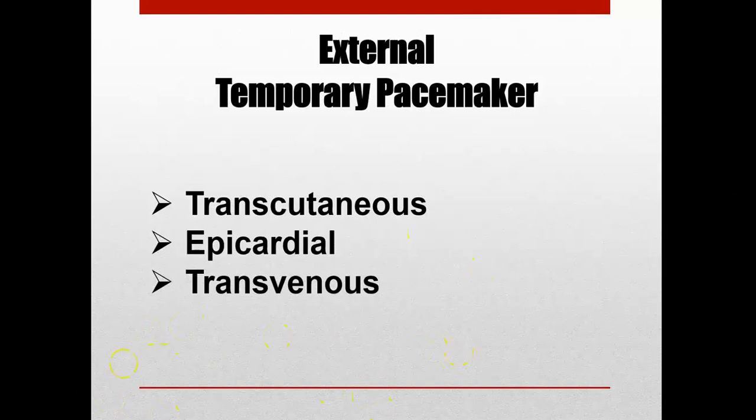The other wire is then used for a positive or a ground electrode, and the leads are pulled through the skin before the chest is closed up. Atrial leads exit on the right side of the sternum below the ribs, and ventricular leads exit on the left side of the sternum below the ribs. So atrial is right side, ventricular is left side, both under the ribs.